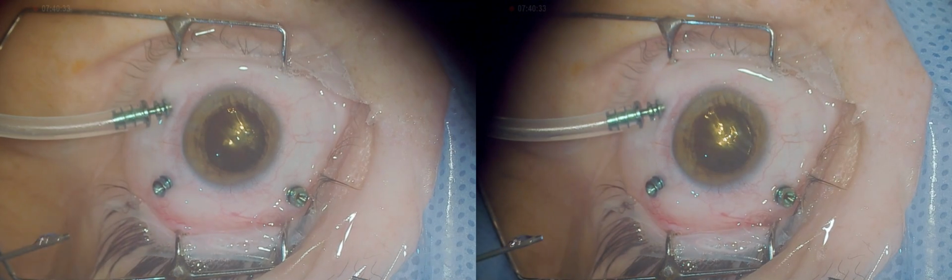Fluid-air exchange, FAX, is the next step of the procedure now. And why is that? To follow on with the ILM, internal limiting membrane, peeling to further relieve any traction secondary to fibrous proliferation that could well be interwoven in the internal limiting basement membrane of Müller cells.